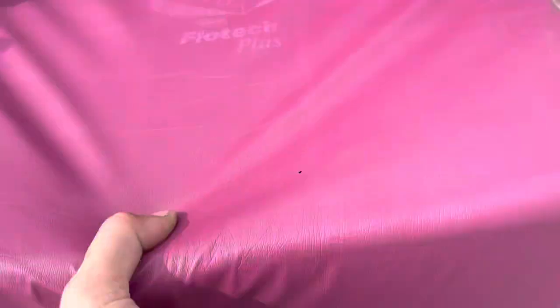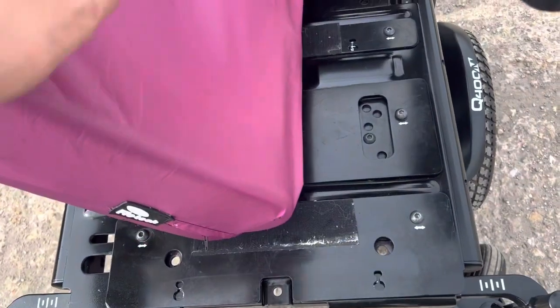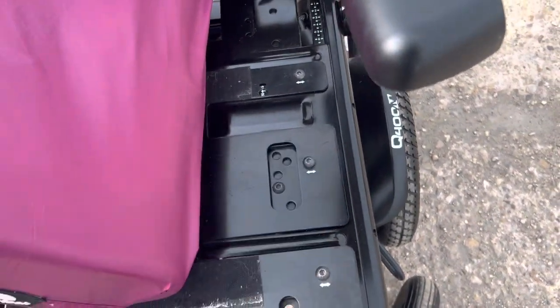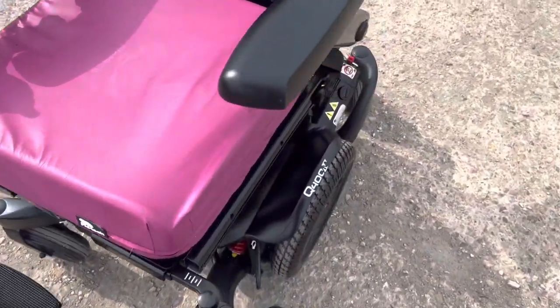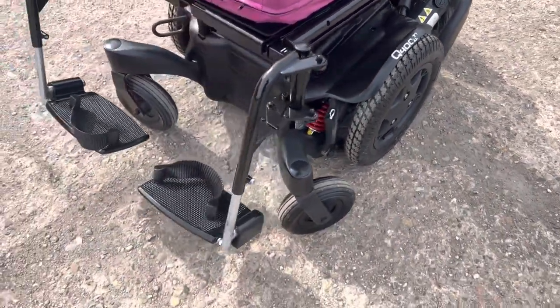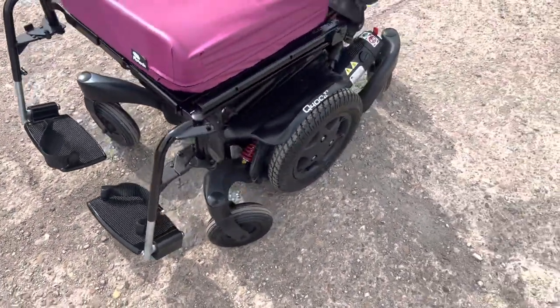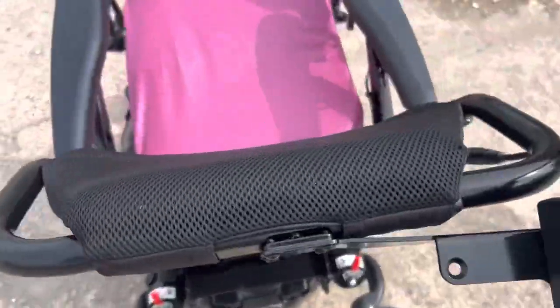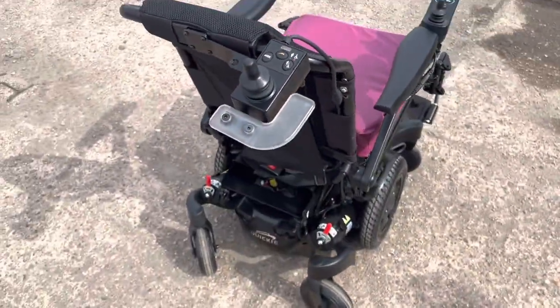It also has a system where the width can be extended or shortened entirely — you can make it wider or narrower. This is the Quickie Q400R. As a refurbished model it's in great condition; brand new these are around £8,000, and we currently have this for sale at £1,495.